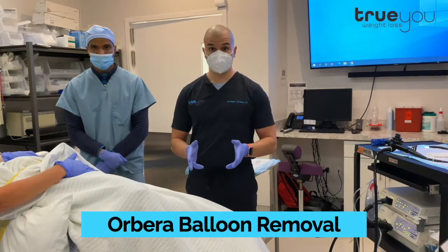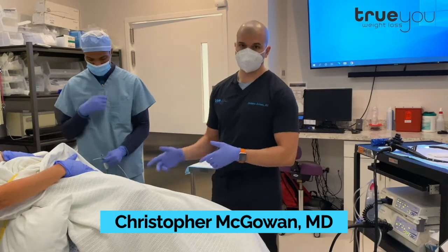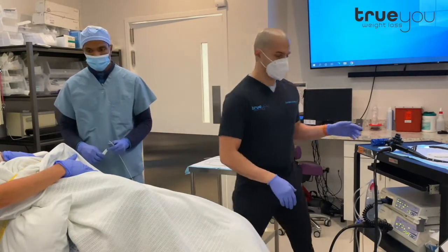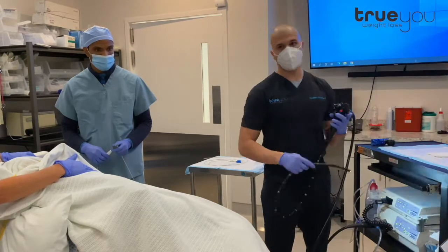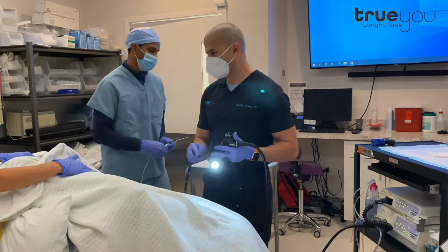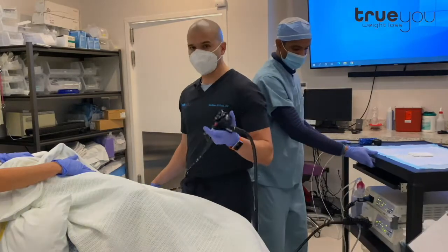We're doing an Orbera balloon removal today, and I'm going to walk you through the process and explain how we do it. Our patient has had her balloon for six months and she's lost a lot of weight — actually 115 pounds, which is way more than the average. The average is about 30 to 50 pounds, but she is an overachiever. So in six months she's lost 115, and it's time for the balloon to come out.